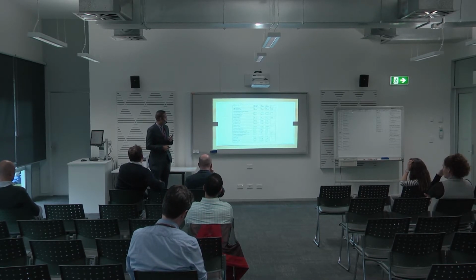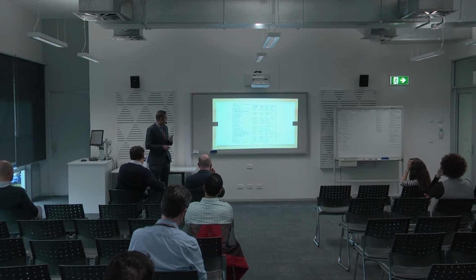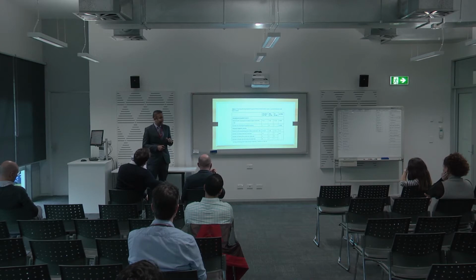So just quickly going through this slide, we looked at the baseline characteristics, which were quite similar in both the groups. And we looked at disease extent and things like family history and primary sclerosing cholangitis, because that increases the risk of bowel cancer in these patients. Okay, so this is my key slide here. We looked at the non-polypoid lesions, so lesions that are less than 2.5 millimeters in height were called non-polypoid dysplastic lesions, as they are worldwide.